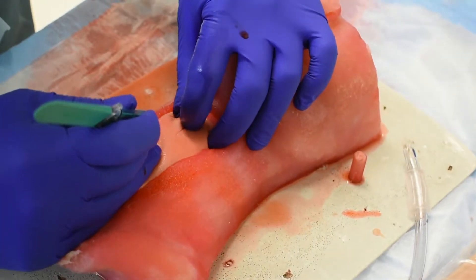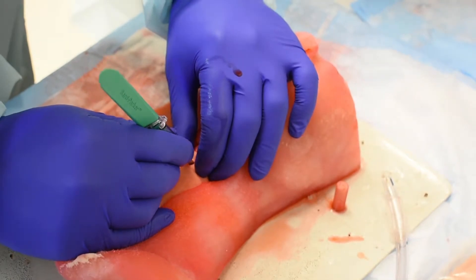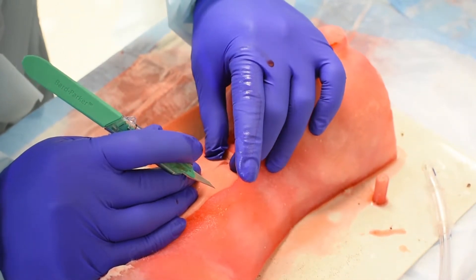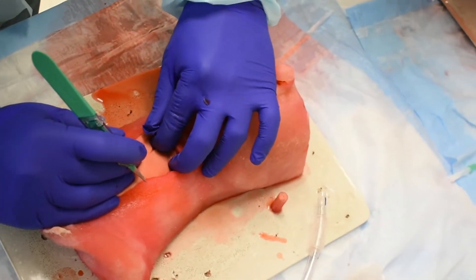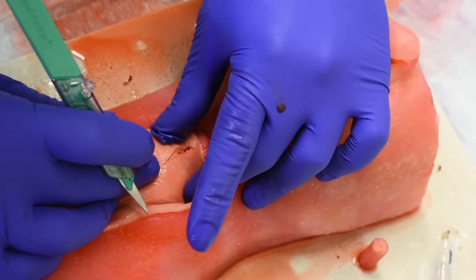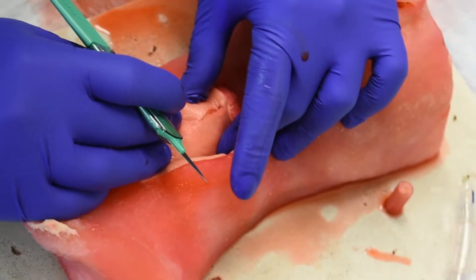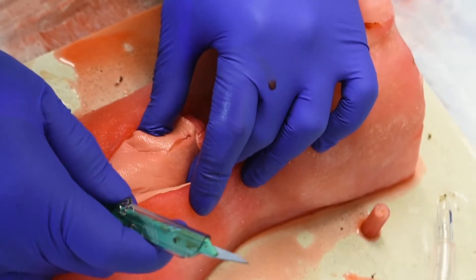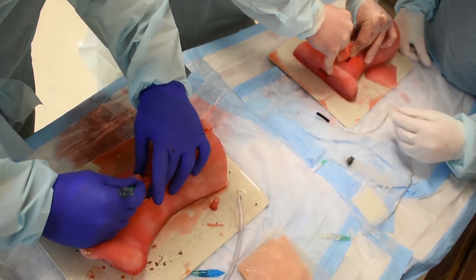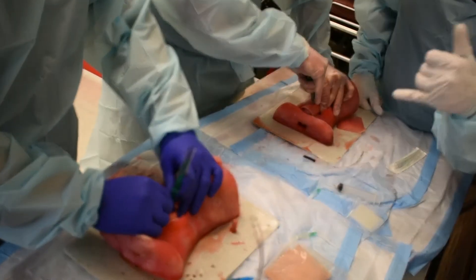You need to get more real estate on that — make that cut at least an inch long. Really separate it. If it's in a linear fashion, the surgeons can put this back together very beautifully. That way they won't look like Frankenstein. Make your incision and spread that tissue apart with your middle finger and your thumb, then take your finger and dissect that tissue. Always keep the scalpel straight. You have to figure out how you're going to keep that hole open — either be careful with that scalpel and shield it, or put the blade through and turn it. You made your hole big enough.